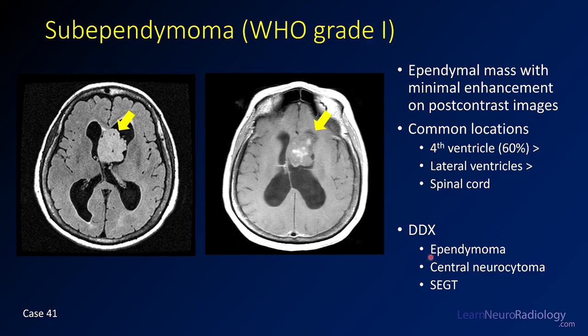Most ependymomas enhance more avidly. Central neurocytomas as well. Subependymal giant cell tumors are those associated with tuberous sclerosis — they can have a similar appearance, but they also tend to enhance a little bit more. Non-enhancing intraventricular mass: probably subependymoma.